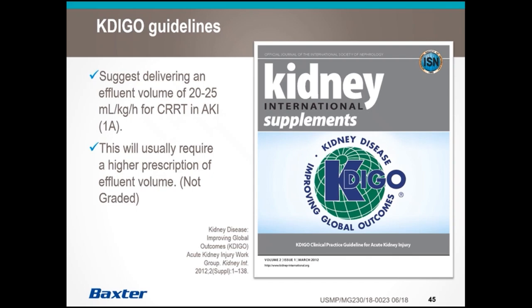The guidelines suggest delivering an effluent volume of 20 to 25 mLs per kilo per hour for CRRT in acute kidney injury. And this is a level 1A indication, which means it's highly recommended and there is strong quality evidence to support it. The effluent volume or effluent dose, these can be considered interchangeable terms, is actually the fluid that's being programmed into the CRRT machine that is in turn being removed or pulled into the waste or effluent bag.